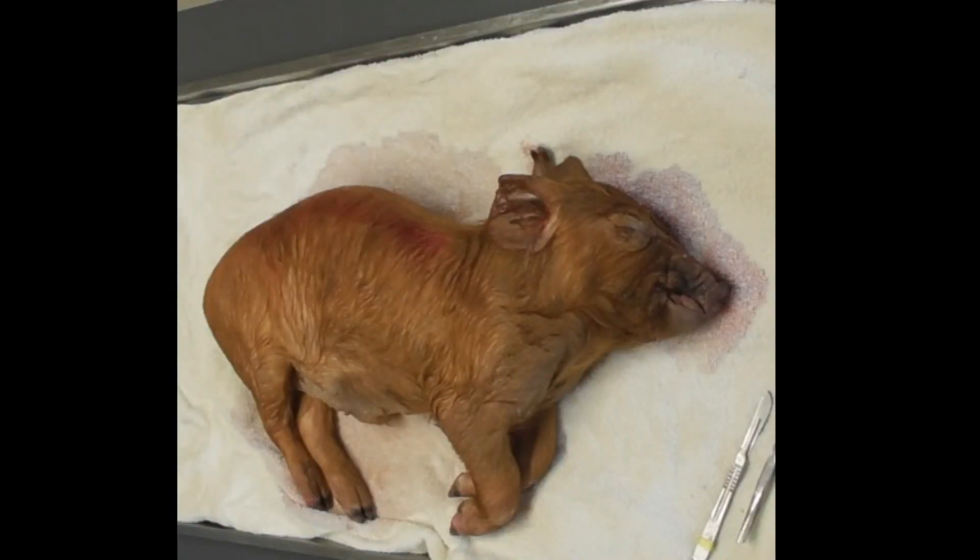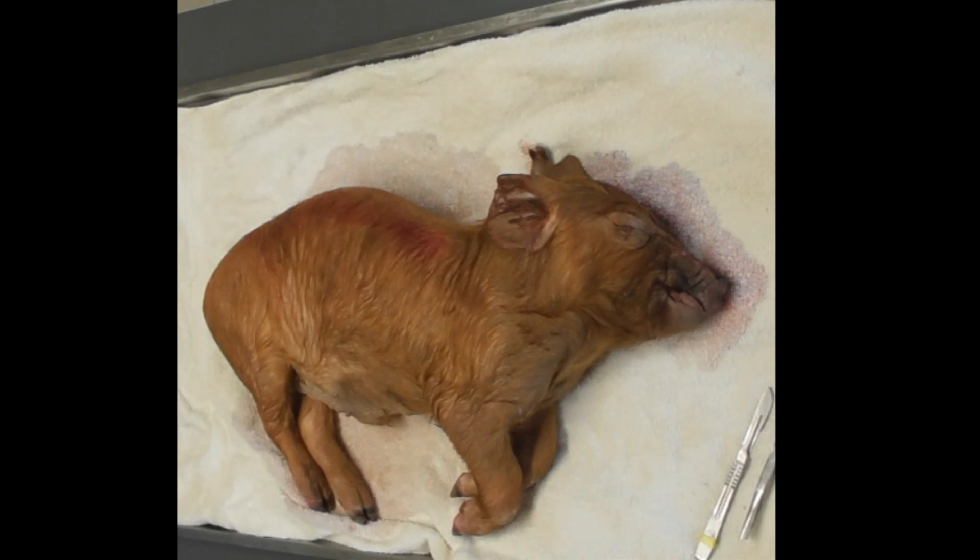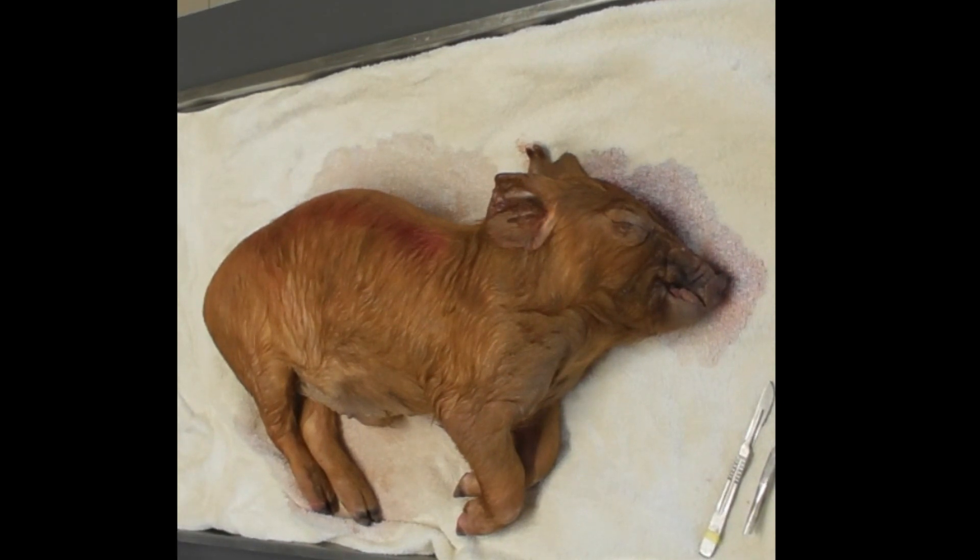Today we'll be going through a post-mortem of a pig. We won't be going into too much about sampling tissues, which would also form part of a thorough post-mortem, but today we've just gone through the process. Ideally we would perform it on fresh tissue or freshly dead carcasses, but these ones have been frozen, so keep that in mind. We'll go through and try to familiarise ourselves with what looks normal, keeping in mind that some of these ones might have had illnesses. As we walk around we'll be able to point out any abnormalities that are present.